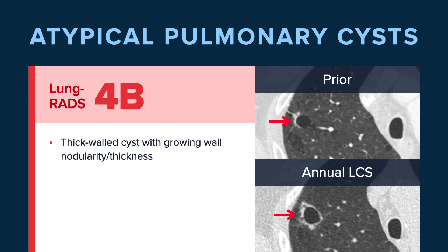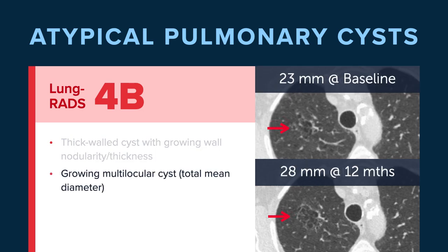IV-B is reserved for thick-walled cysts that demonstrate growing wall nodularity or thickness. As we see in this example, we have a prior thick-walled cyst — it would have been a Lung RADS IV-A — but over time the wall thickness has increased, there's more nodularity, and it is now a Lung RADS IV-B. Growing multilocular cysts: even if they don't develop a solid component, just an overall increase in the size of a multilocular cyst will warrant a IV-B classification.